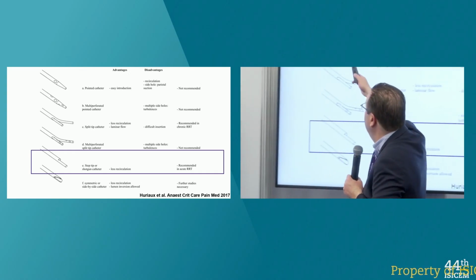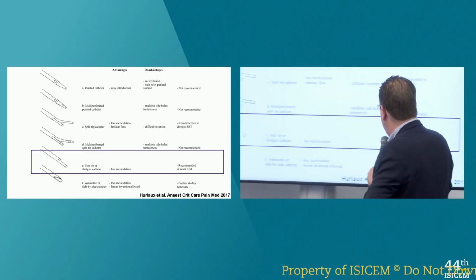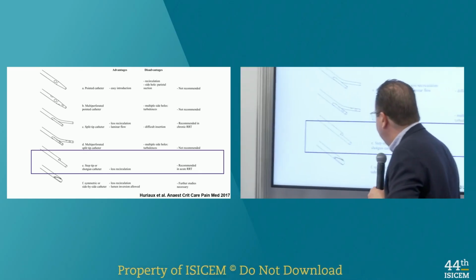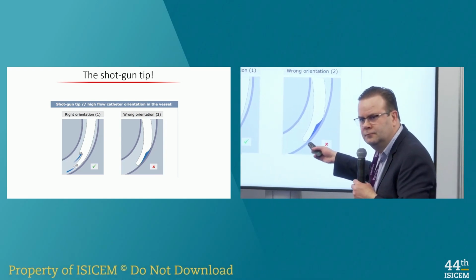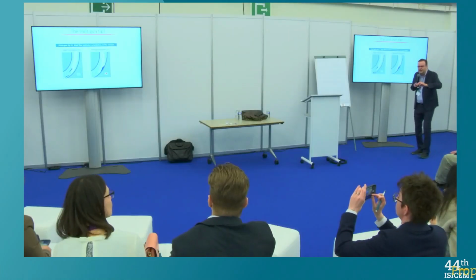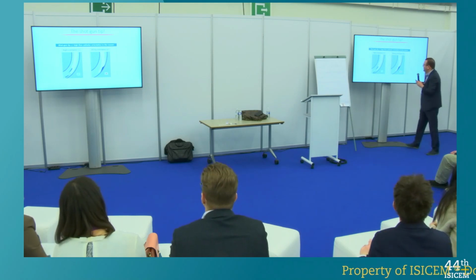So if you still have these catheters, you should change to this catheter, which is the shotgun catheter. Shotgun catheter is the recommended catheter at this time. Sometimes you have this problem, but the nurses, I don't know if we have nurses here. Any nurses? If we have nurses, they know very well how to switch to get this position.